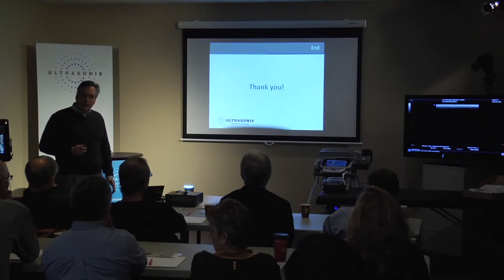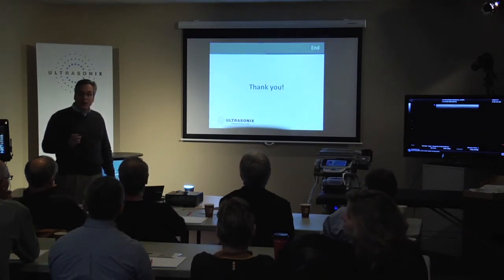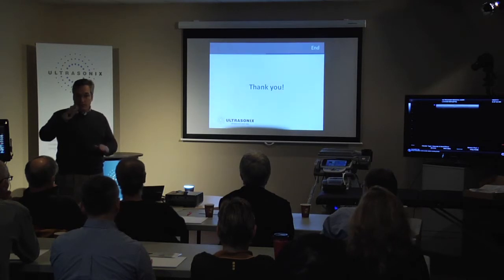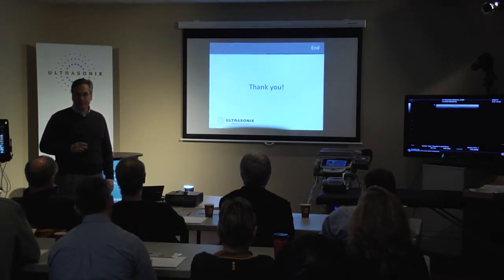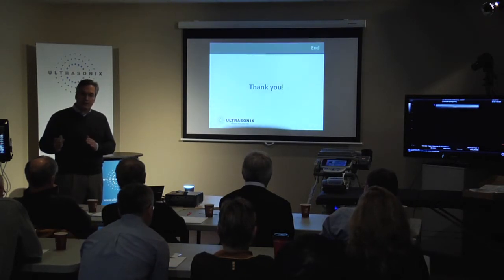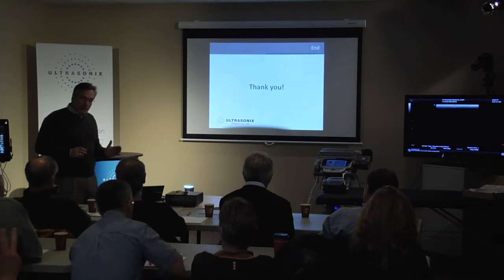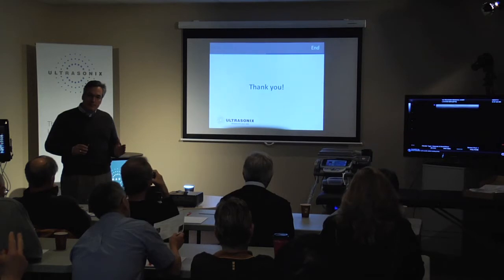You used spatial compounding with Power Doppler? No, because it's a physical firing electronic system that knocks you out of color, because it really requires you to take advantage of multiple steering and timing of the echoes being sent into the body and collected back. No. So there's times when you want to use compounding and there's times when you don't. And you cannot combine the spatial compounding with harmonics?